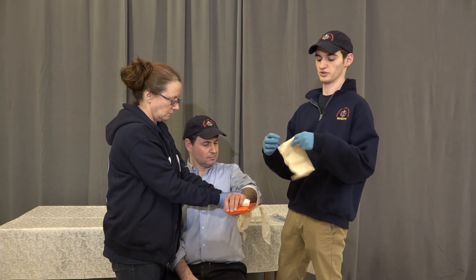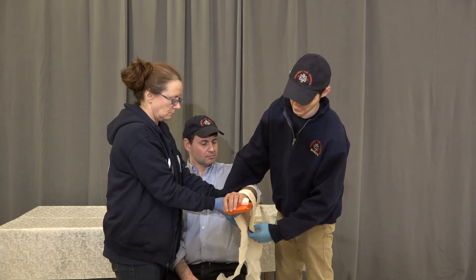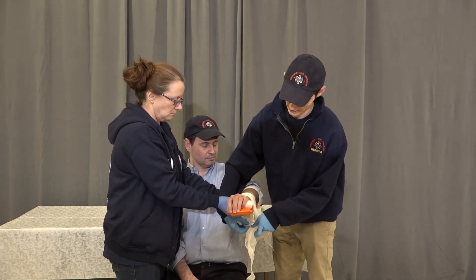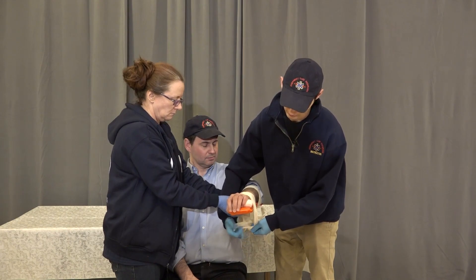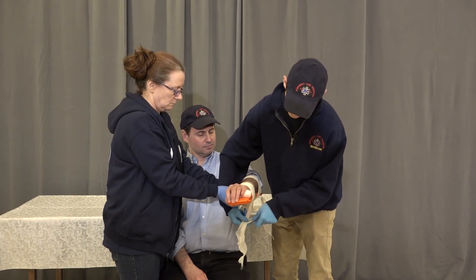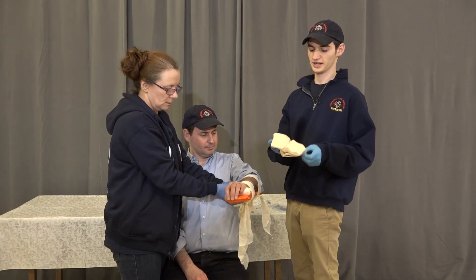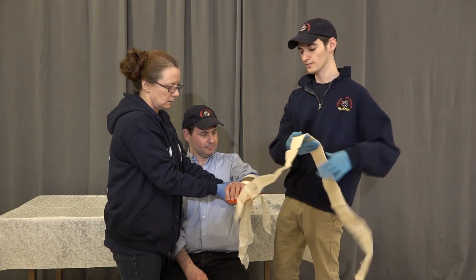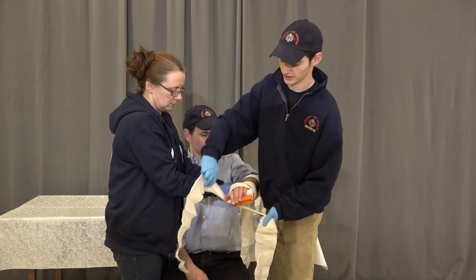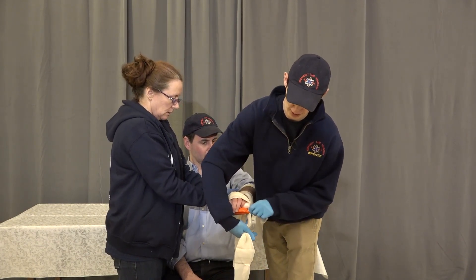The next tie is going to be below the site of the injury but above the wrist. And again we're tying a surgeon's knot over here as well. The next tie is going to be over the hand. We're first going to come over the four fingers excluding the thumb, and then as we come around the hand again we're going to catch the thumb. Then tie a surgeon's knot on the board.